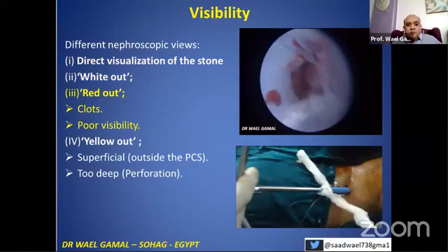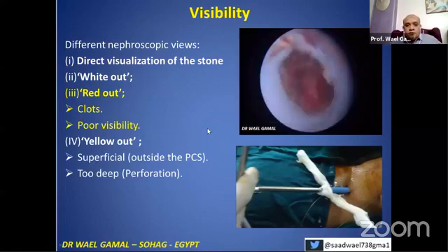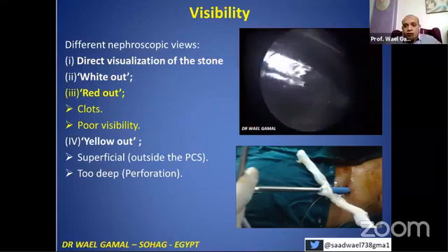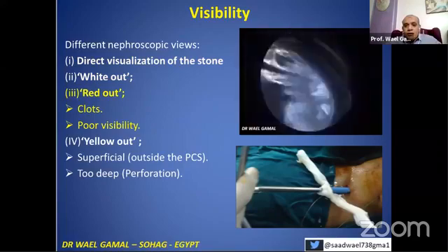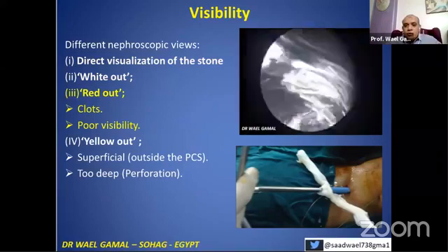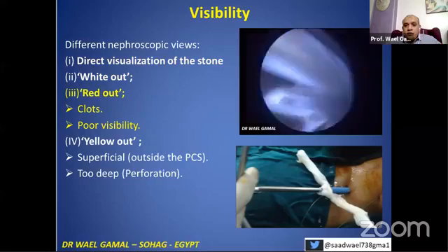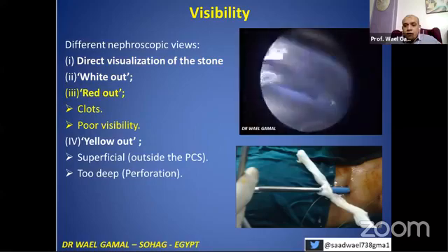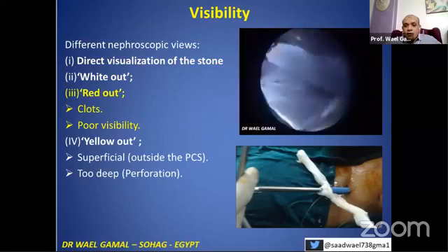There is what's called red out. You may see clots like this. These clots mean there have been multiple trials. You may find these clots. You need to put your sheath inside and with suction, you can direct the sheath up and down and suction all these clots.